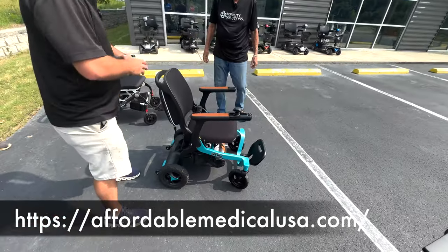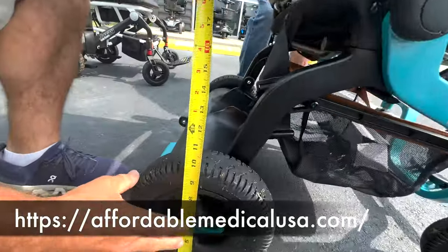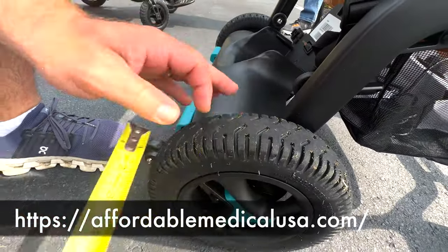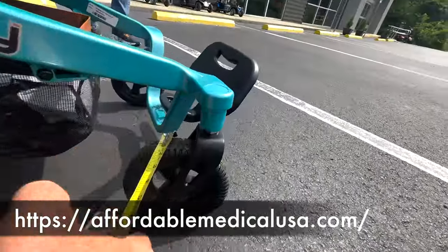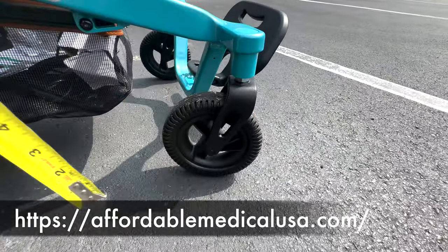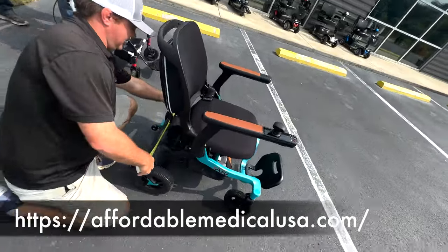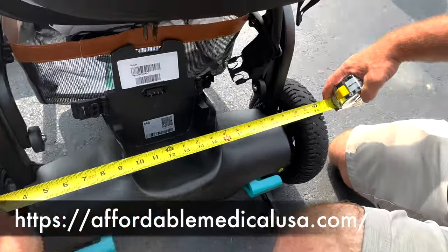All right, so let's check out these tires while we're here. About 9.5 inches. Pretty nice size tires. Air for a smoother ride. Front tires are thicker. And the height of it. Overall width at the wheelbase is 24 and a half, a little bit less than 25.